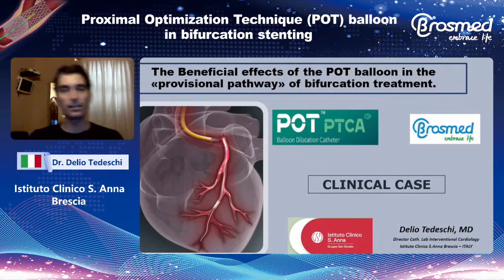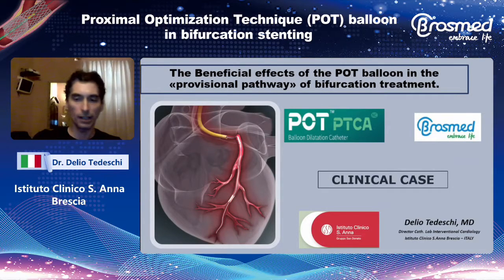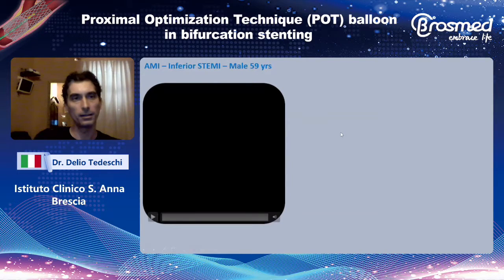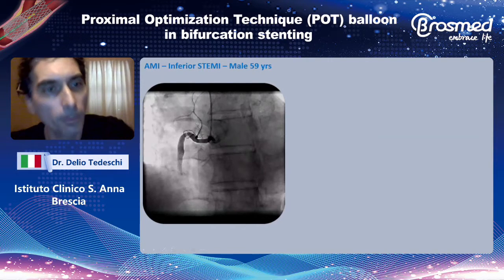Okay. This is a very didactic, very educative case, in order to understand the usefulness and the utility of this pot balloon in a real world case of acute coronary syndrome. So this was a 59 years old male that arrived in my hospital with an acute myocardial infarction.